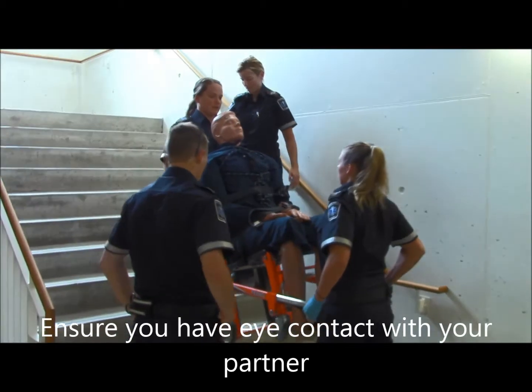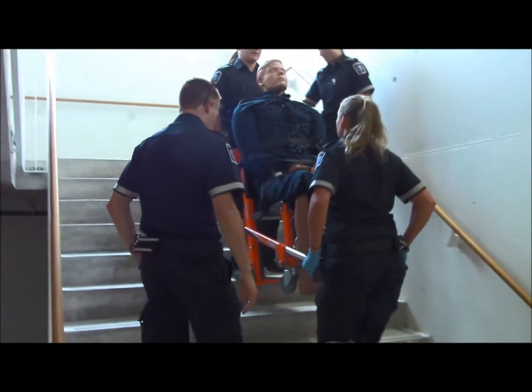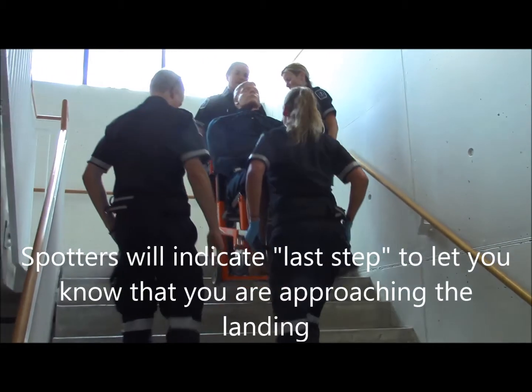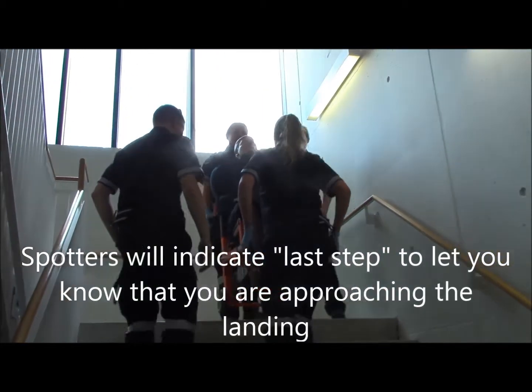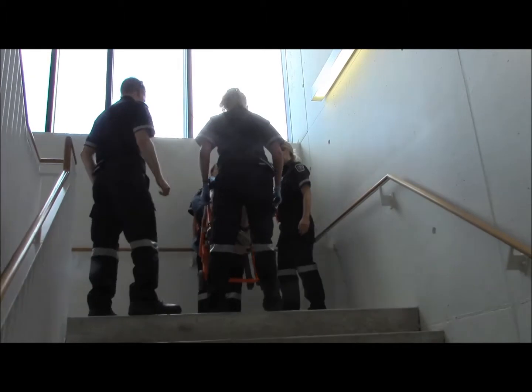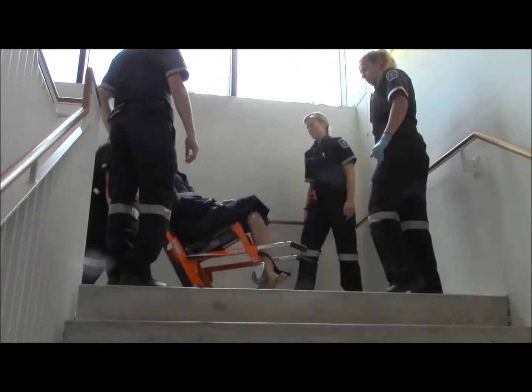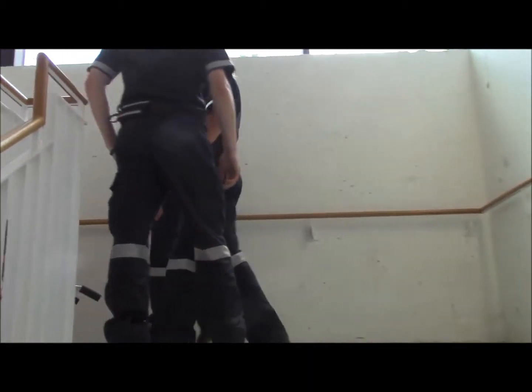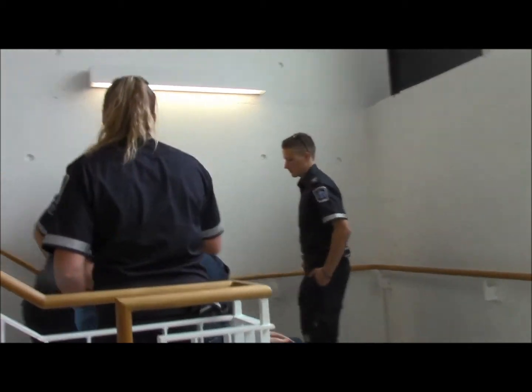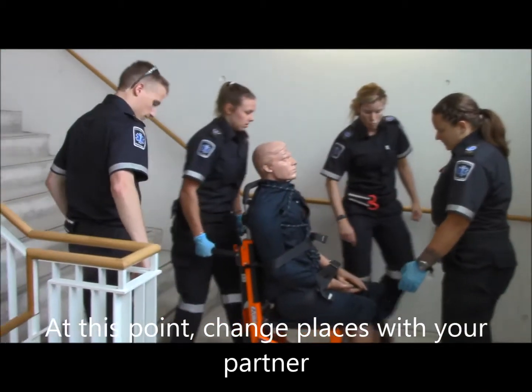As you begin your lift, please ensure that you make eye contact with your partner. What you don't hear in this video is the student at the head end will now be saying step, step, step as they ascend the staircase. At this point, you're going to trade places with your partner to continue with the ascent.